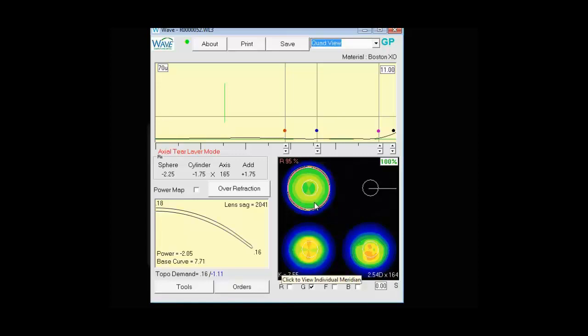The upper left is your front curvature view. This is the front curvature of the contact lens. Upper right is a simulated fluorescein pattern. The lower left is the back curvature of the contact lens. And the lower right is the view of the cornea.